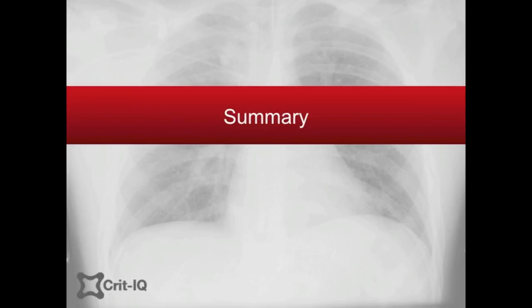In this vodcast, we have reviewed how the ventilator responds to the patient who attempts to initiate their own breaths. Through the modes assist control ventilation, SIMV and pressure support, the ventilator applies varying degrees of support to facilitate ventilation.